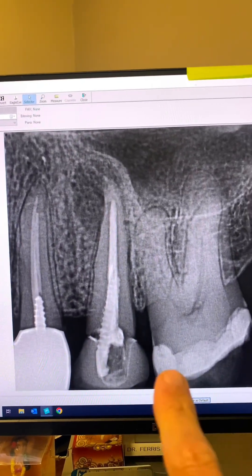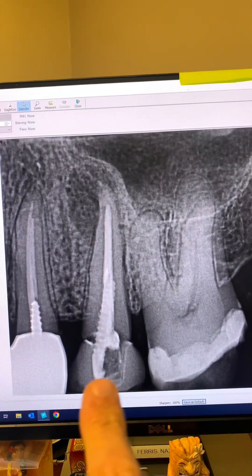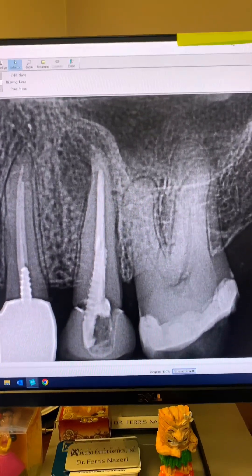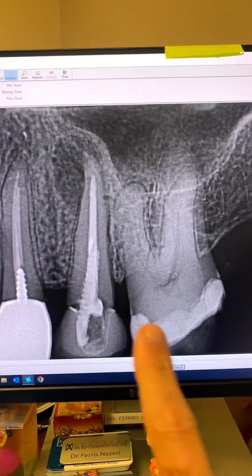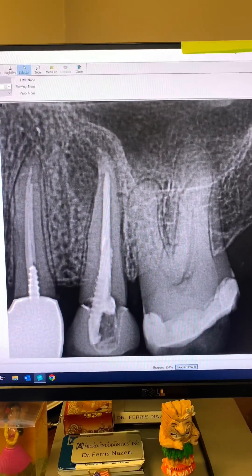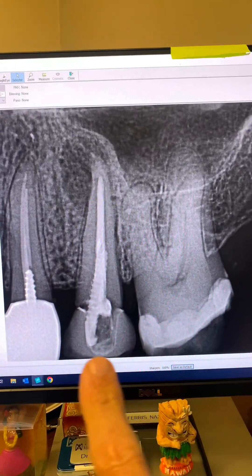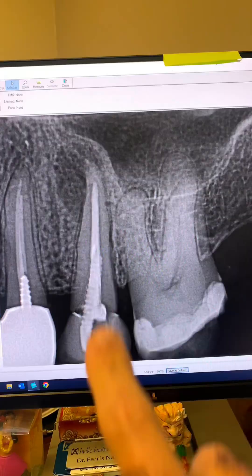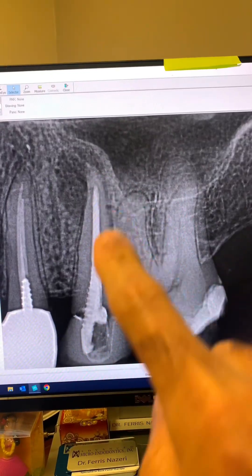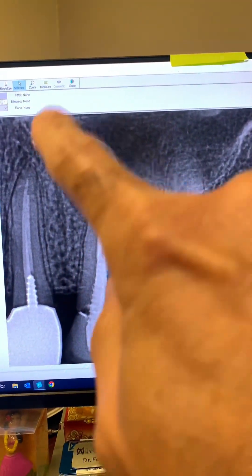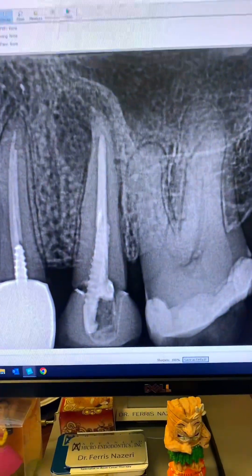Take a look here. You can see a crown on the tooth. The patient, by the way, says the crown is about two years old. You can also see a prefab metal post, the previous root canal, and a large periapical lucency here.